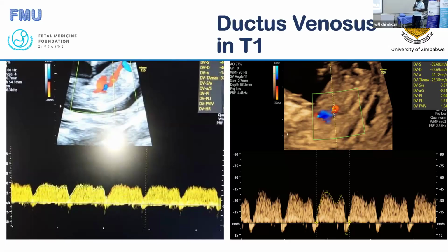So in the first trimester, usually if you have such a waveform, and all the aneuploidy screening tests have been done and they are normal, this is a candidate to book for a fetal echo, a detailed echo, for thorough examination of the heart.